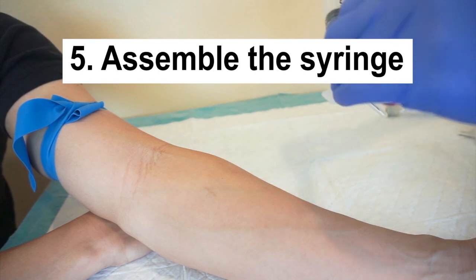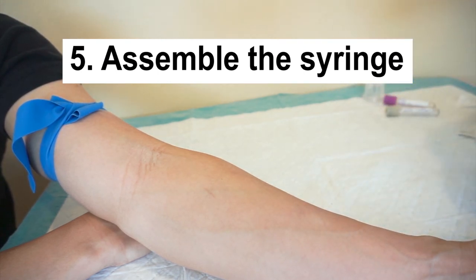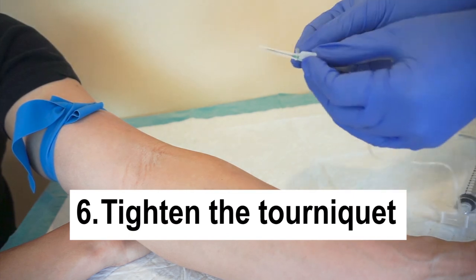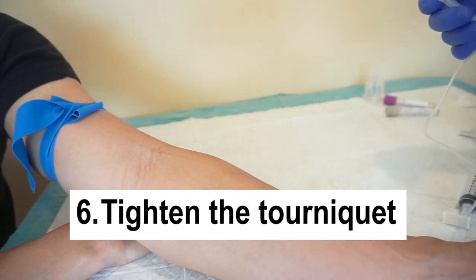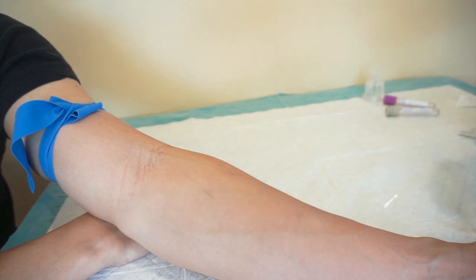Fifth, pull back the syringe plunger a few times to loosen it up so you will have an easier time pulling back once inserted into the patient. Sixth, tighten the tourniquet 3 to 4 inches above the draw site. Make sure that the tail of the tourniquet is away from the site.